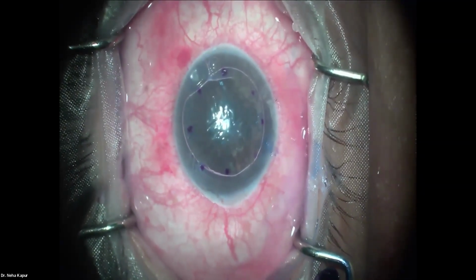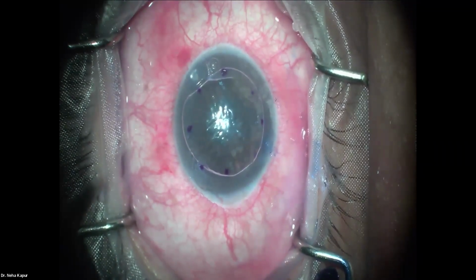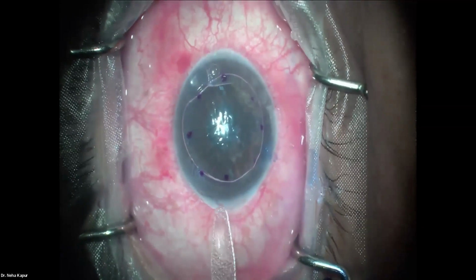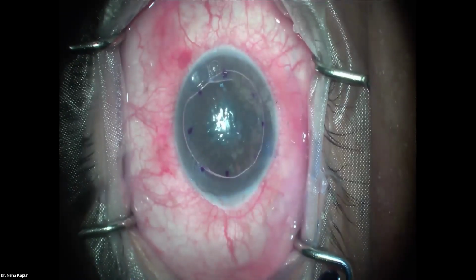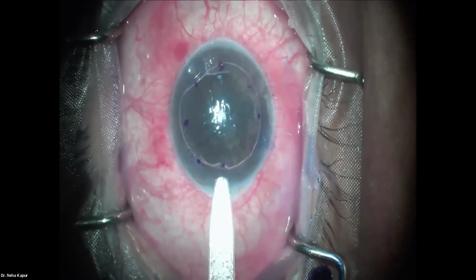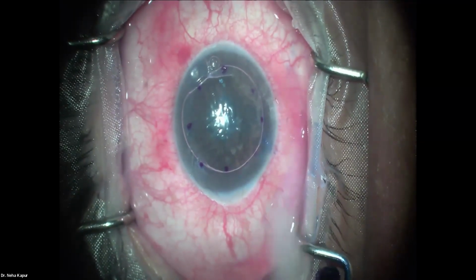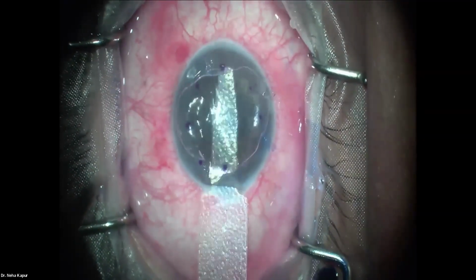And now we are clean. Just pick the Sheets glide and place it in the eye, reaching the opposite angle.